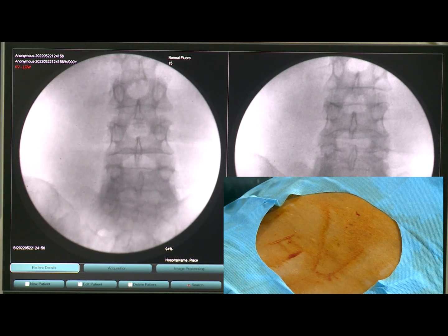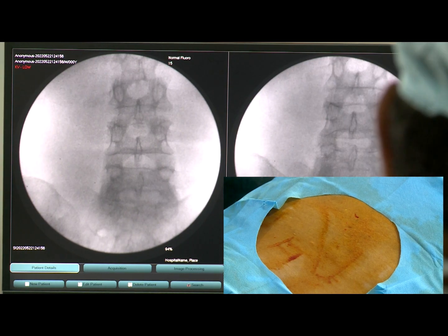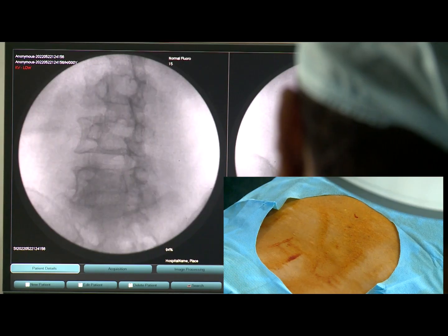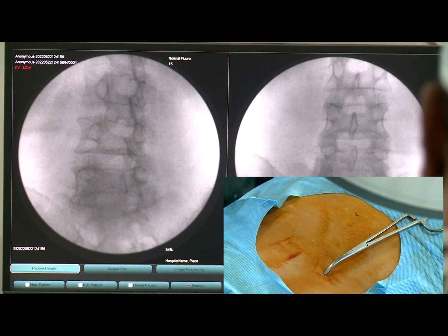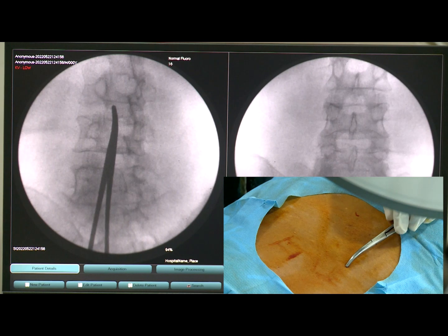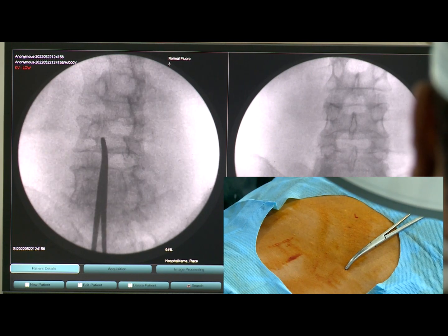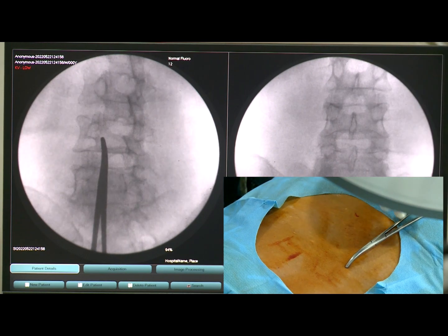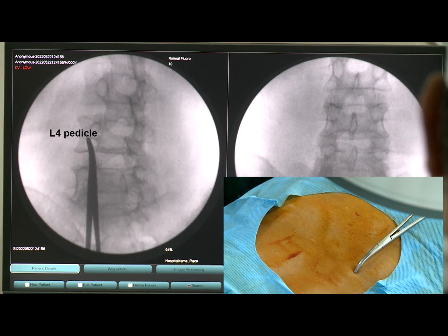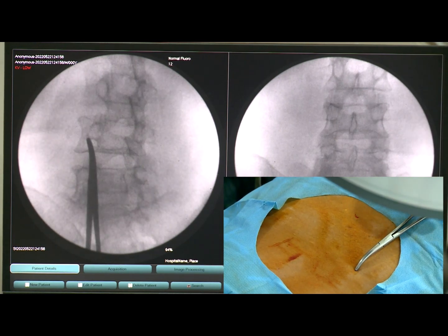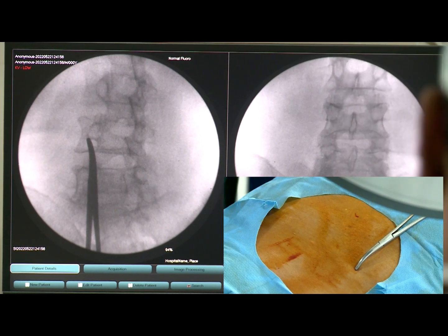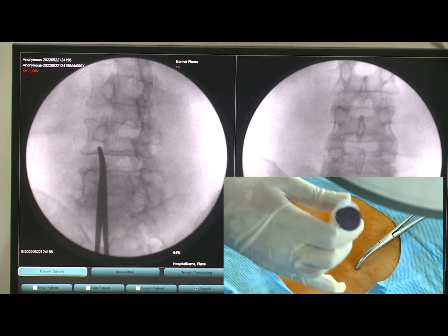Now the end plate is parallel and we will be making the ipsilateral oblique view. You can see the pedicle. I am moving the pedicle to the top position of the pedicle, and that is my needle entry point.